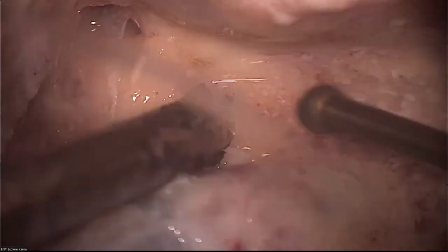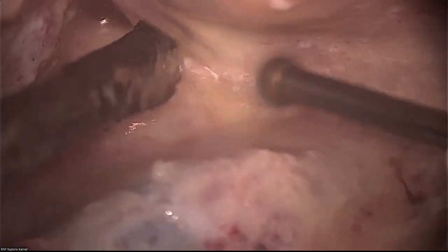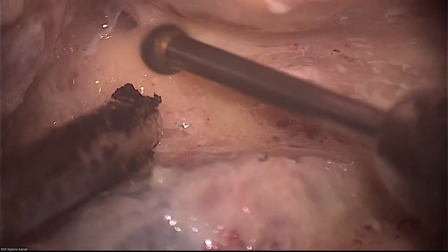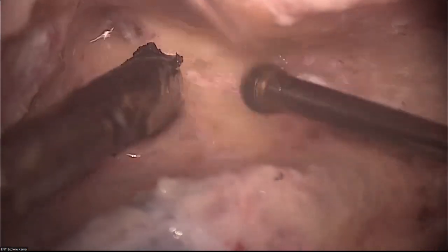Now, I have seen both the nerves. What I am trying to show you, see this. I was running my drill parallel to the incus to uncover the facial nerve which is below. Now, just to show you, I am raising the magnification one level up. Can you see both the structures together? Yes, sir, we can see.